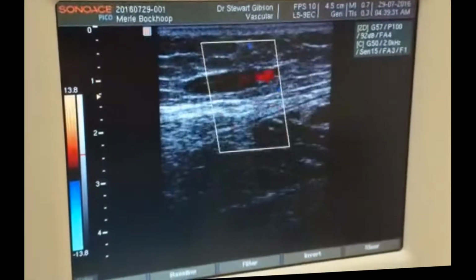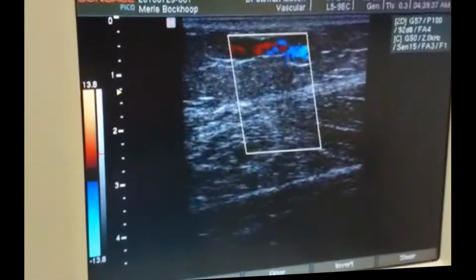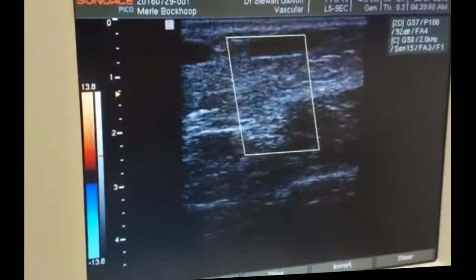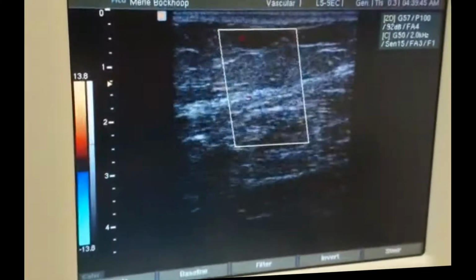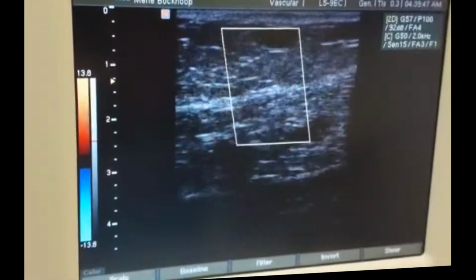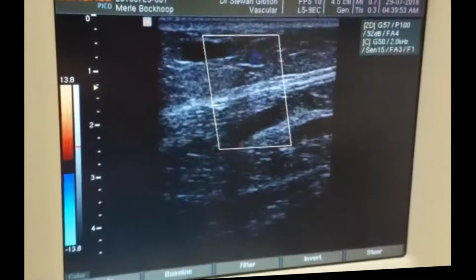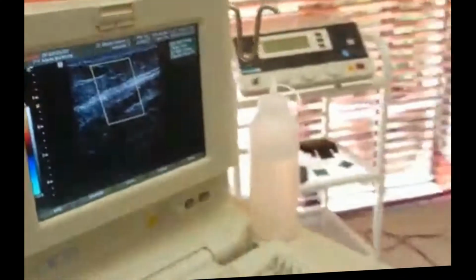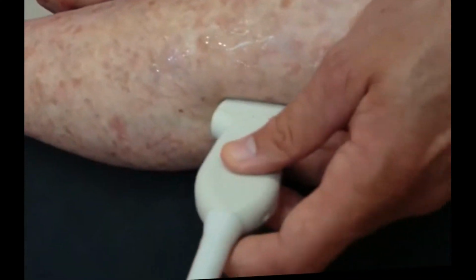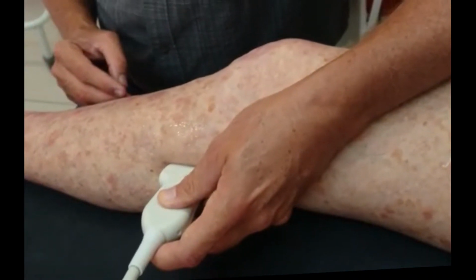blood vessel feeding into it, we do in fact see that there is another connection to a posterior accessory vein which is pulsatile. It's difficult to say exactly where the arteriole is introducing its flow, but this is definitely coming from posterior. If you look at the position on the leg, you'll see that we've moved to the posteromedial aspect.